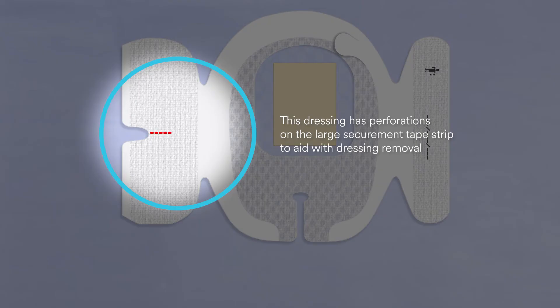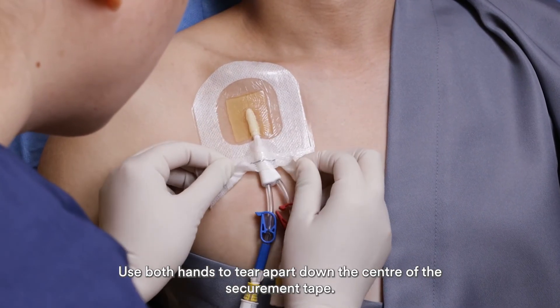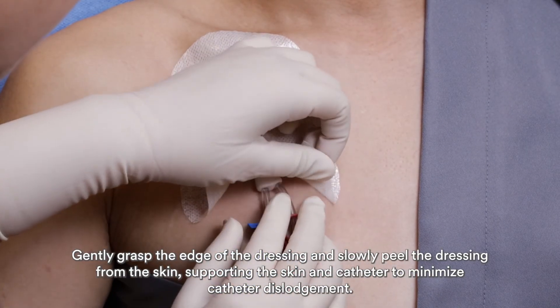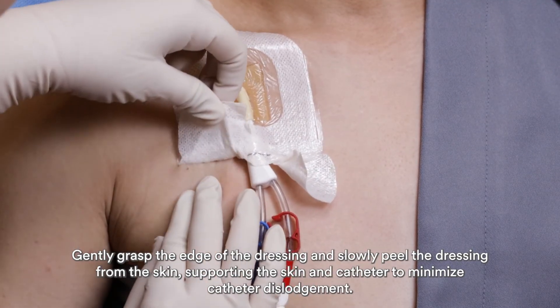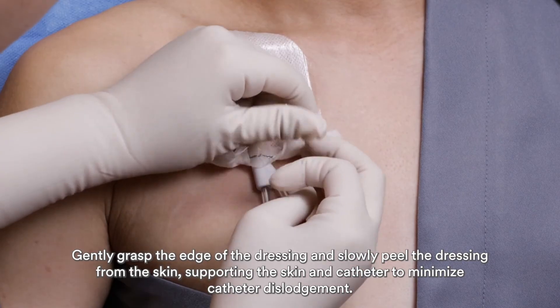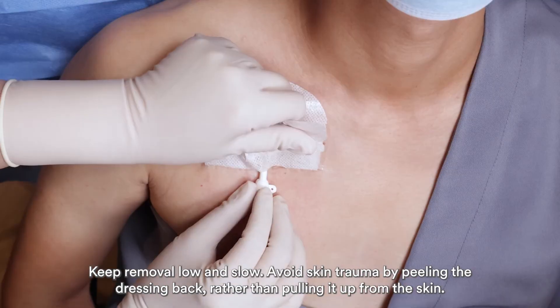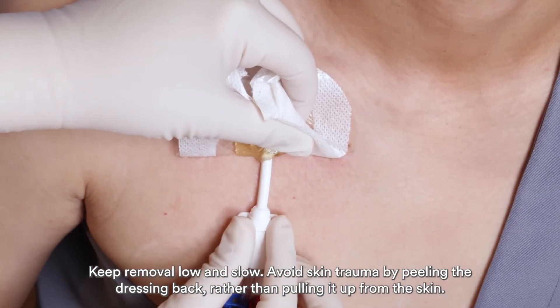This dressing has perforations on the large securement tape strip to aid with dressing removal. Use both hands to tear apart down the center of the securement tape. Gently grasp the edge of the dressing and slowly peel the dressing from the skin, supporting the skin and catheter to minimize catheter dislodgement. Keep removal low and slow. Avoid skin trauma by peeling the dressing back rather than pulling it up from the skin.